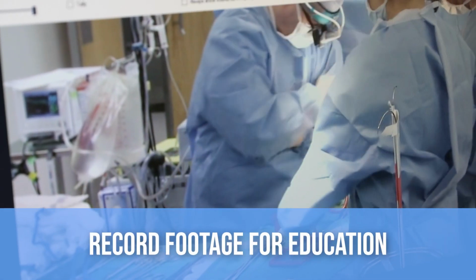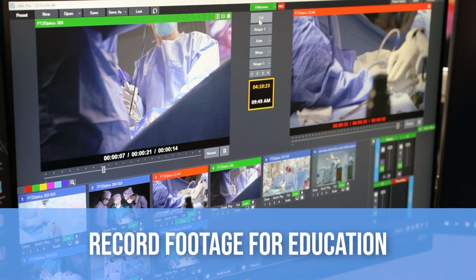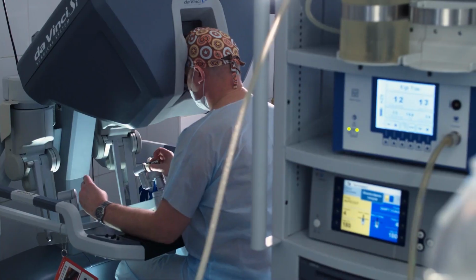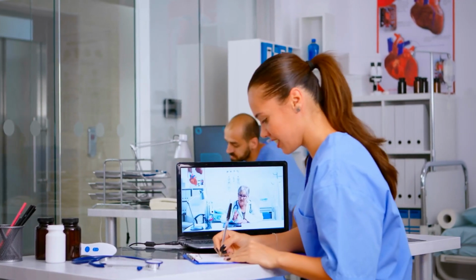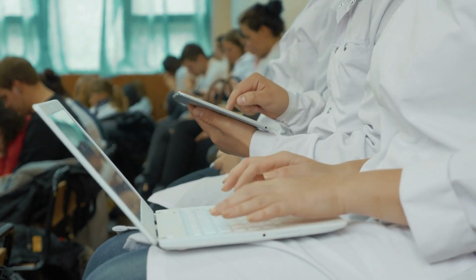At the same time, it's common to record video from one or more cameras during a surgical procedure to use for educational purposes. In this video, we will demonstrate a surgical video recording system which can display video for students in an on-site location, but also in the classroom across campus.